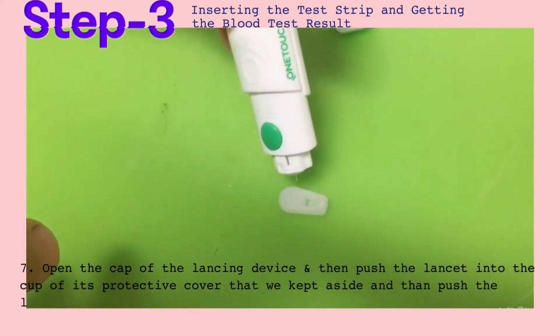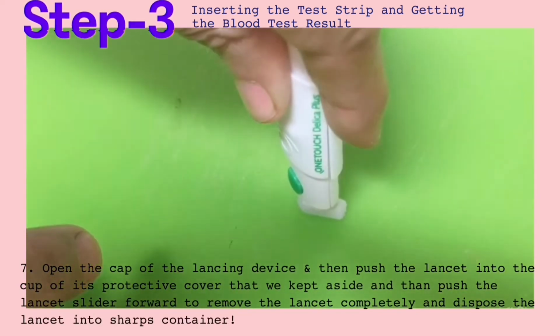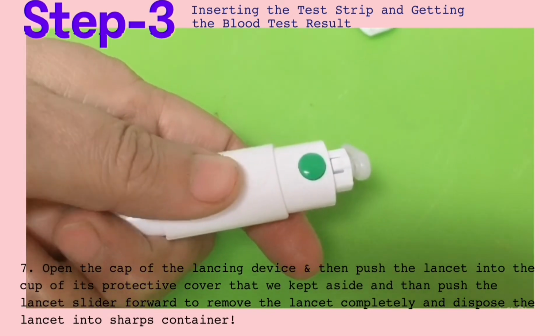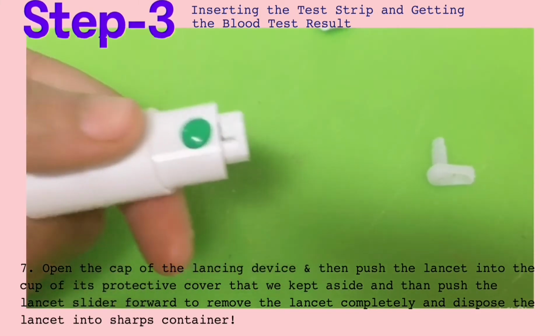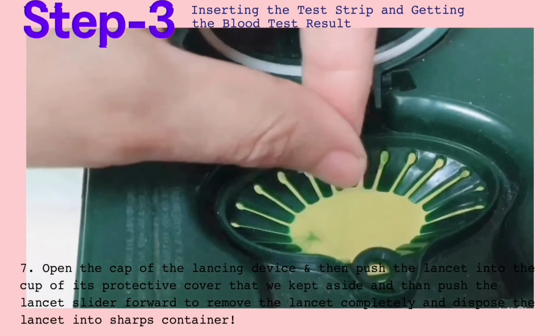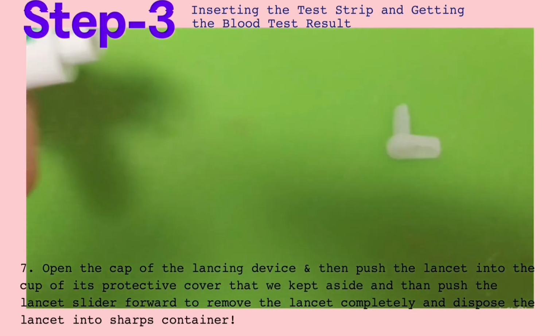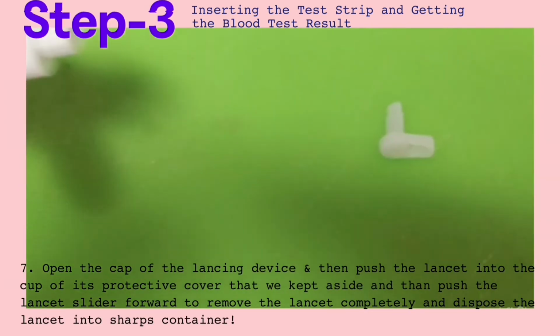Open the cap of the lancing device and then push the lancet into the cup of its protective cover that we kept aside, and then push the lancet slider forward to remove the lancet completely and dispose the lancet into the sharps container. It is strongly recommended to change the lancet with each use. Remember, do not reuse the lancet for poking.